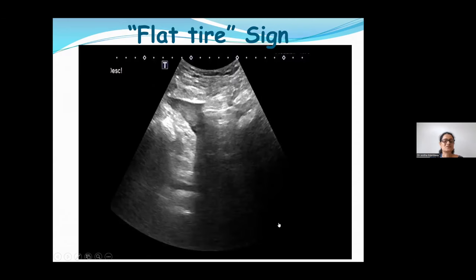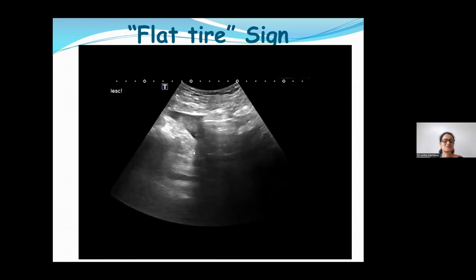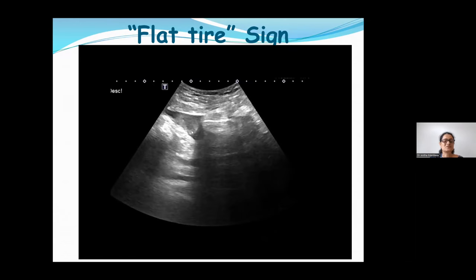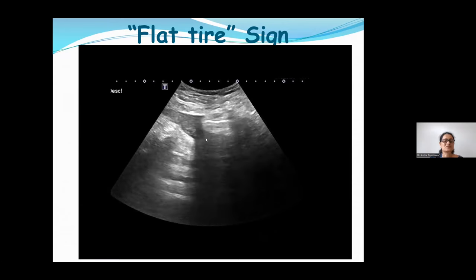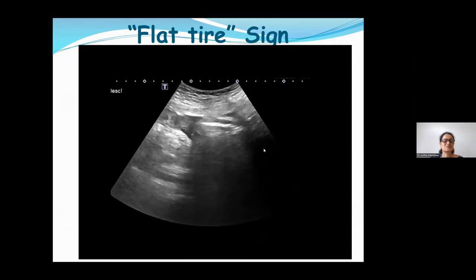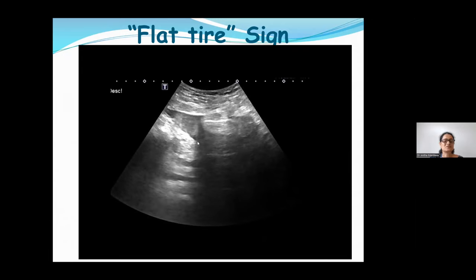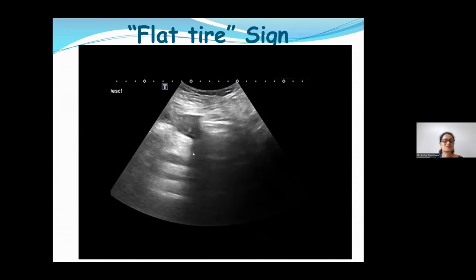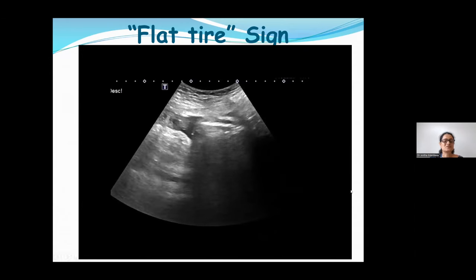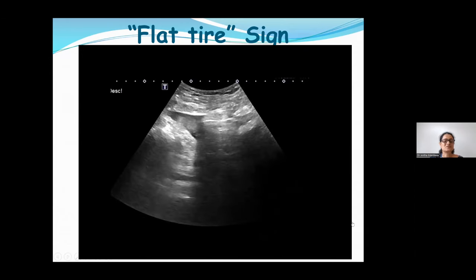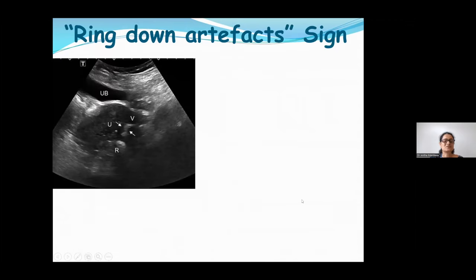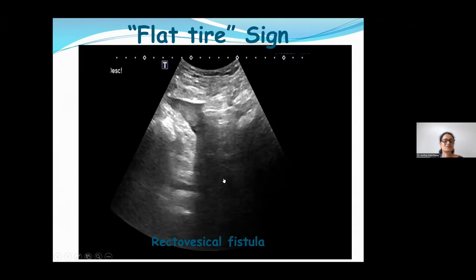The flat tire sign: whenever air is seen passing into the urinary bladder in a known case of malignancy, you must think of a vesical fistula. This clearly demonstrates the passage of air into the urinary bladder from a rectal mass. Whenever there is a vesical fistula, look for this flat tire sign.